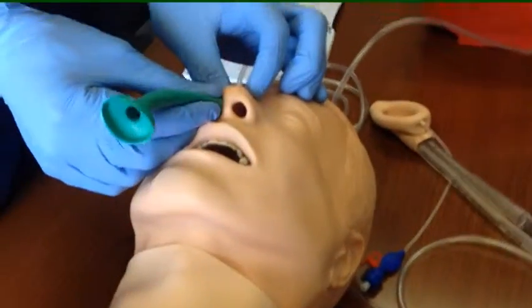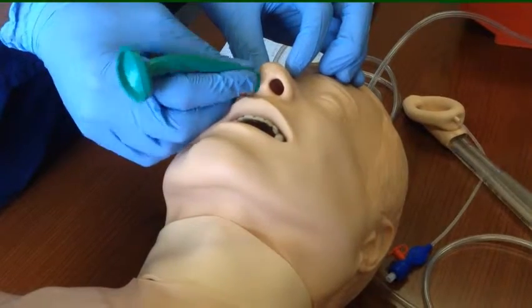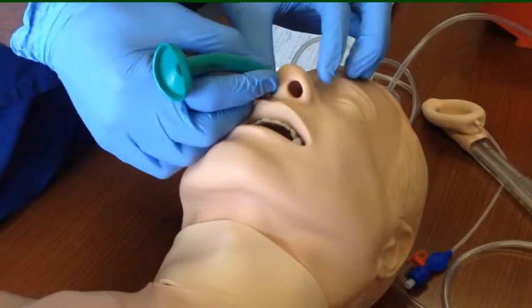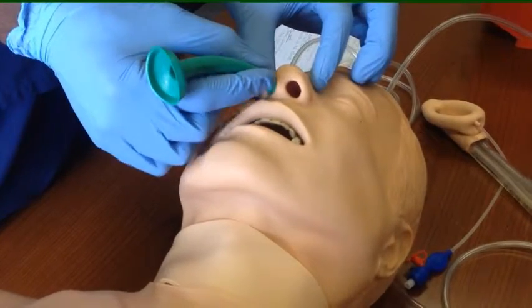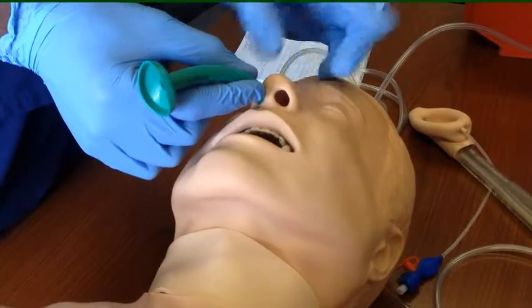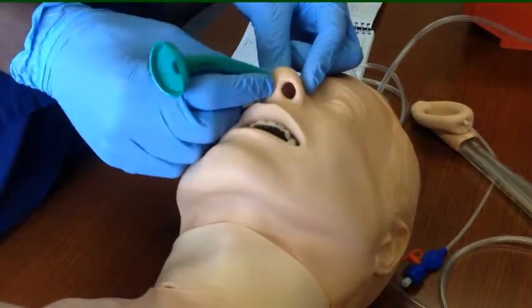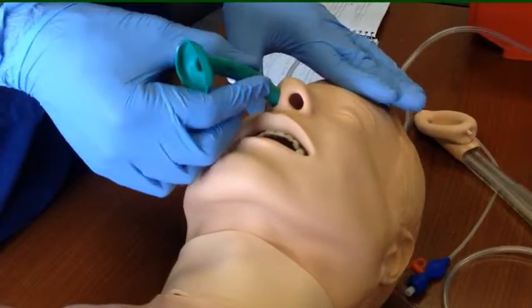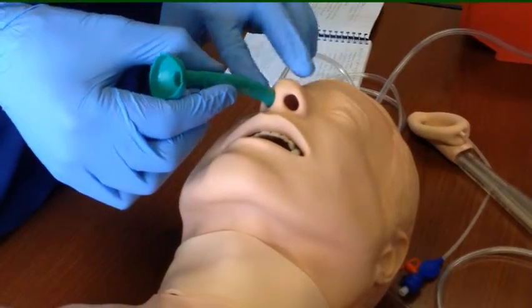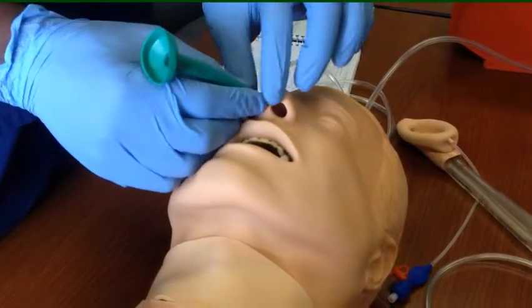You have to make sure that you are not facing any resistance. If you face any resistance, stop, pull it back a little bit, and then adjust it that way so you don't face any resistance, because if you go against resistance, you may end up causing trauma inside the septum, and if you cause bleeding, you may not be able to stop it easily since it's inside. So you advance it all the way. For the purposes of this demonstration, this one may not go all the way in because our mannequin has a problem in the nose, but let's assume it's all the way in.